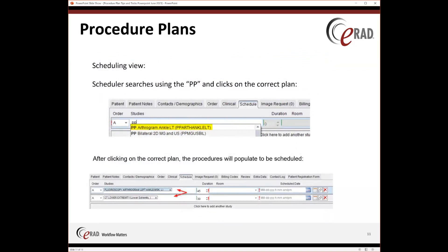Scheduling view. When the schedulers schedule, this is where the 'PP' prefix comes into play and makes it easy for them to actually identify the procedure plans. All I did in that top section is type in 'PP' and you can see that it started to list the procedure plans. The highlighted arthrogram is the one that is chosen, and once it's clicked, you can see in the next diagram that it blows out or basically puts both exams as one order and then has your times there that are allotted for each exam.